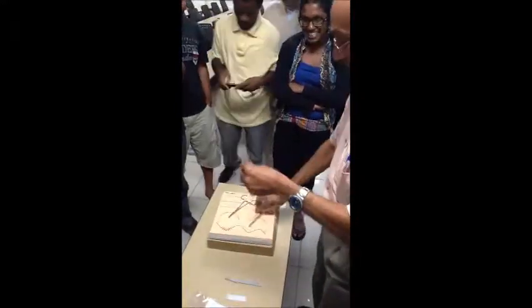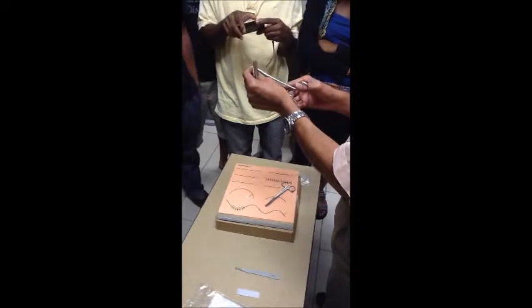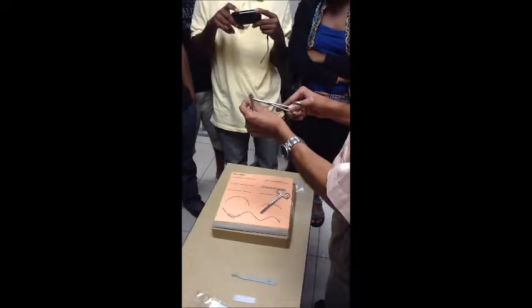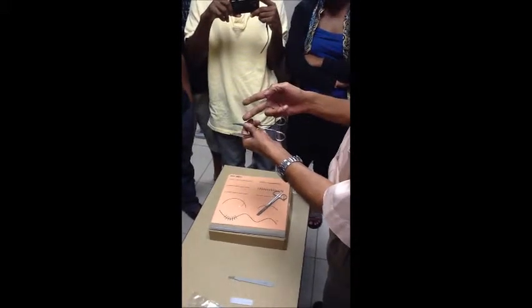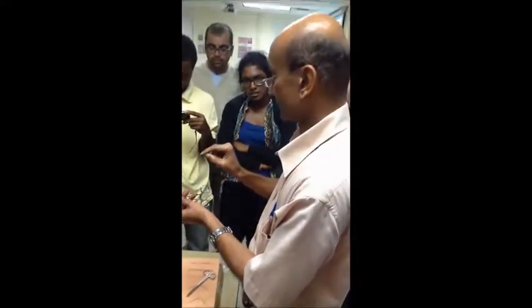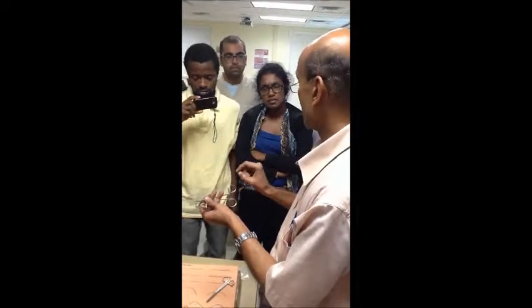Okay. So for those of you who have come today, this is a needle. There are two types of needles. One is a cutting needle, the other is called a round body needle. How do we determine a cutting needle or a round body needle? It depends on the cross-sectional appearance. Suppose you were to take a cross-section through this needle and look at it end-on. If it appears triangular in shape, then it is called a cutting needle. And if the same cross-section appears circular in shape, then it is called a round body needle.